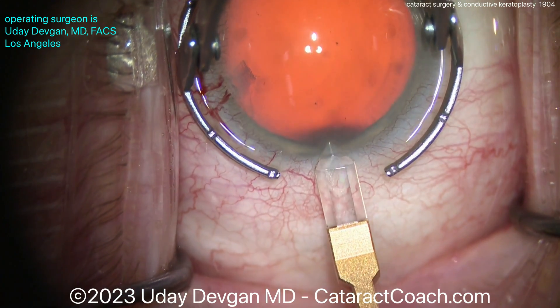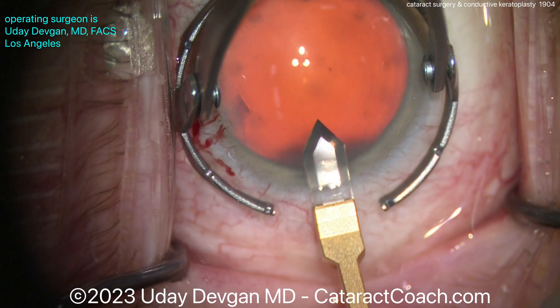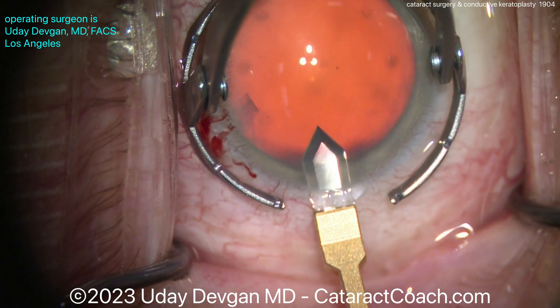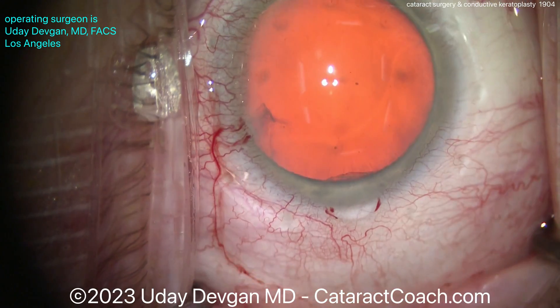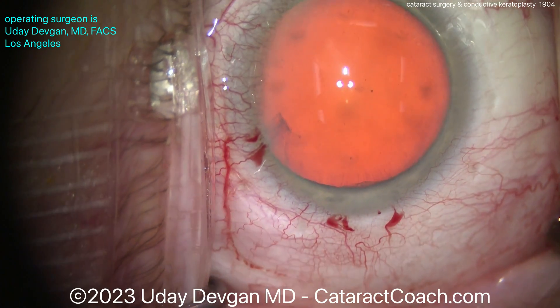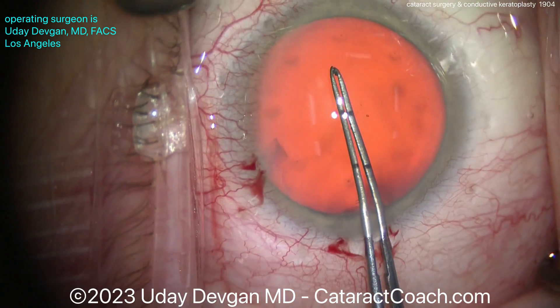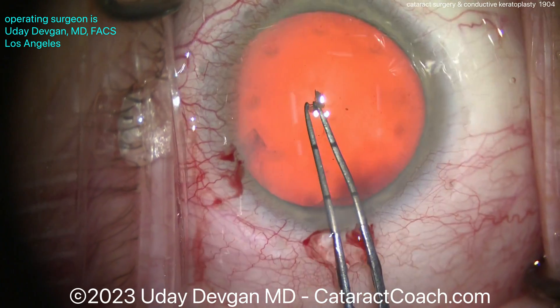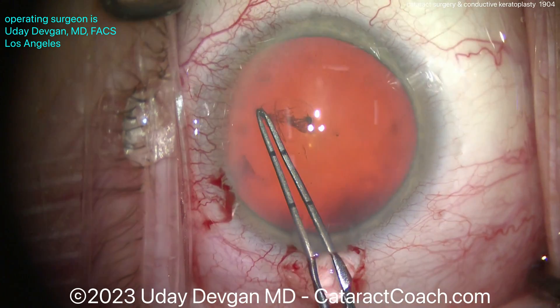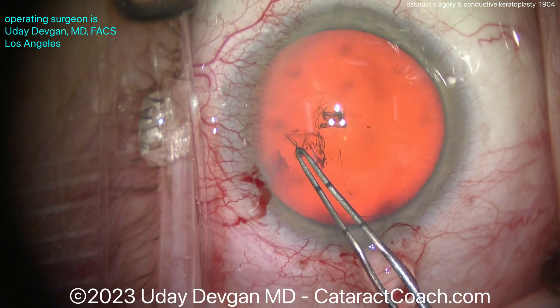Sometimes you'll see 16 spots — basically still the 8 spots but in 2 rings. This patient, as you probably guessed, is a little bit hyperopic — a latent hyperope. In his mid-40s, he had the conductive keratoplasty done in order to dial in a little bit more of a myopic shift in his non-dominant eye.